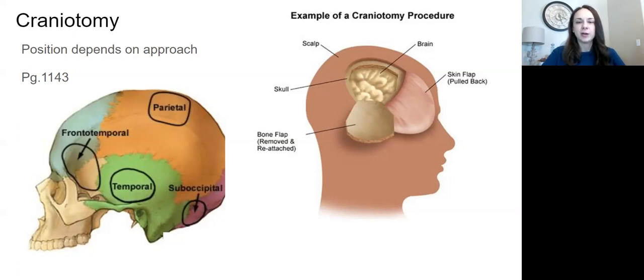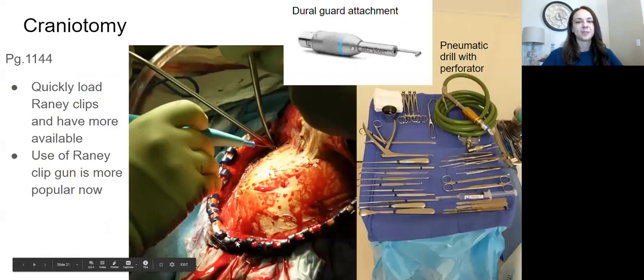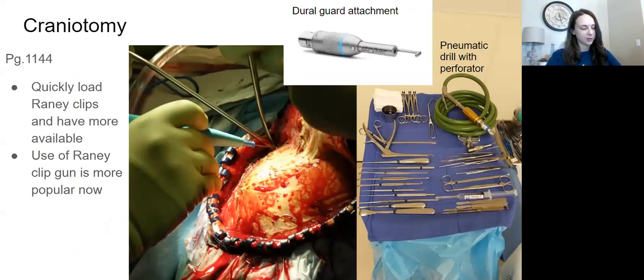So there's your craniotomy, and you can see what it's going to look like after they get the bone flap removed and the muscle pulled back. Oh, I love this picture. This is a really beautiful Mayo setup, first of all. But I want to keep going down the line with this. Let me start at the beginning. Let's say it's a frontotemporal craniotomy. Let's go with that so we're all on the same page, because this procedure just says craniotomy. It doesn't say awake, doesn't say asleep, doesn't say any details. So I'm giving you the detail.